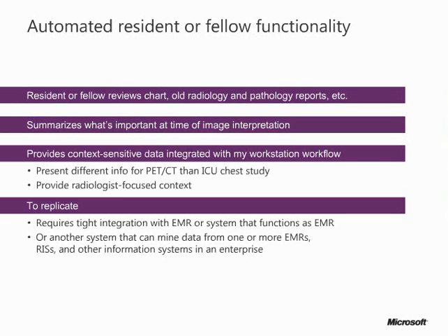And so what I really want is for the system to understand me personally and what type of information I need, just as I'd train a resident or fellow to do that. And then I want it to be context-specific depending on the type of study, depending on the situation, and even depending on the patient's place of origin as far as whether or not it's an ER patient, whether it's seen to be a stat study, or whether it's a routine study. All of those things may affect the way the information is presented to me.